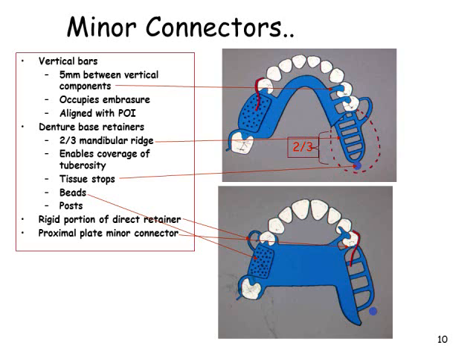Form and location of minor connectors. Like the major connector, the minor connector must have sufficient bulk to be rigid, otherwise, the transfer of the stresses and of the function of other components cannot be effective. At the same time, the bulk of the minor connector must be as unobjectionable as possible. A minor connector contacting the axial surface of an abutment should not be located on a convex surface but, instead, should be located in an embrasure, in which it will be the least noticeable to the tongue.